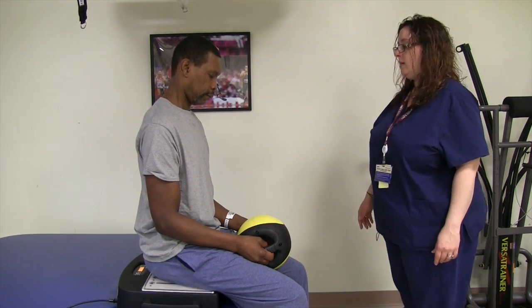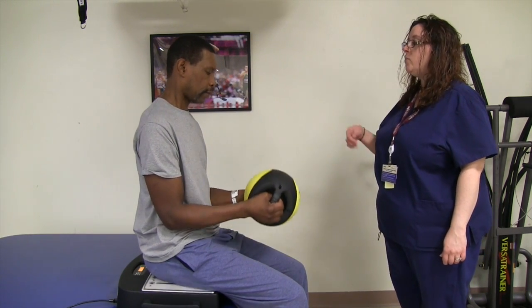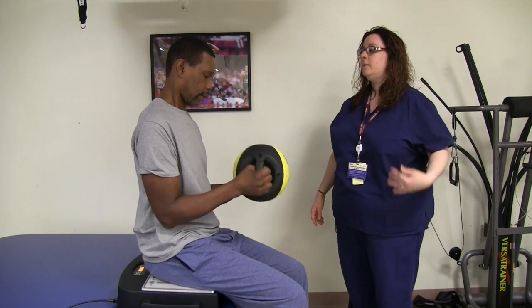Good. Now while you're vibrating, go up and down — good and controlled on the way down. Okay, so come up and then control it on the way down. There you go. Good.